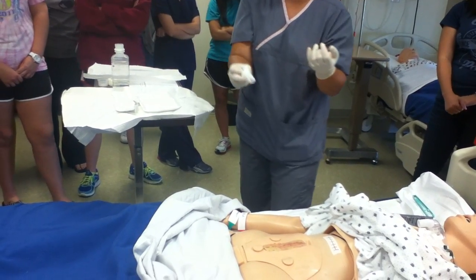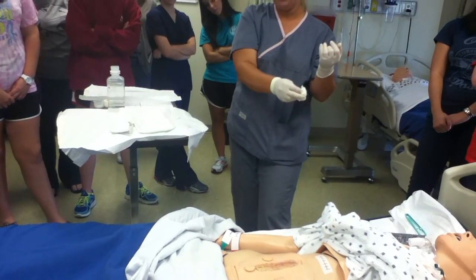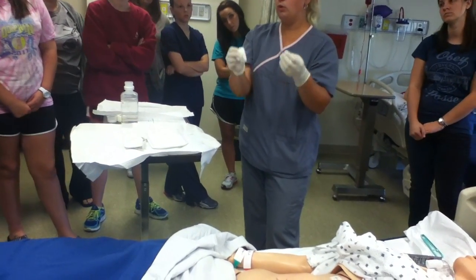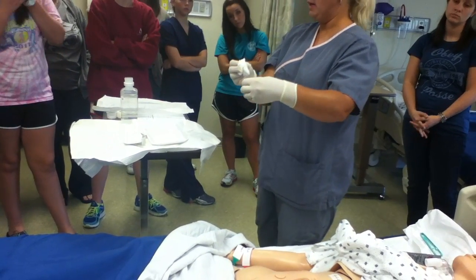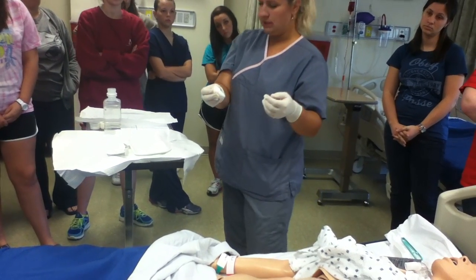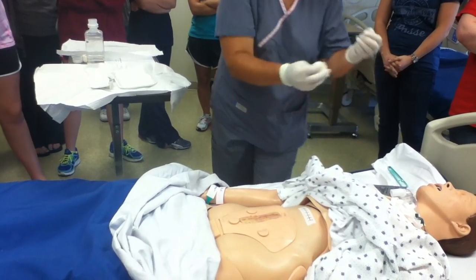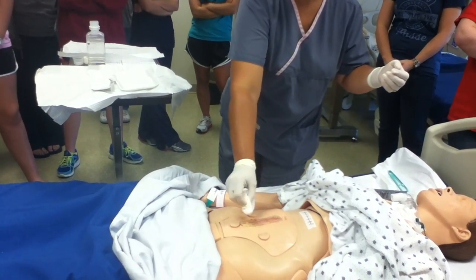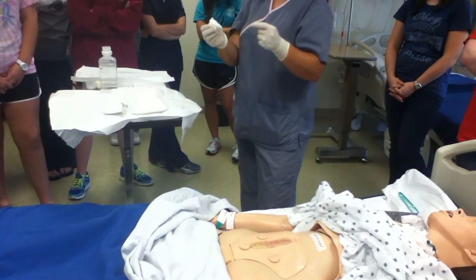I just got it on my tray. And then I'm going to go from here and go out and throw it away. You have to clean a wound per what it actually is. If this was a big round wound, in other words, it was open, I would clean a little bit differently. I would end up starting in the center, clean like this, throw it away, the center like that, and throw it away. But I would stay inside the wound because it was open.